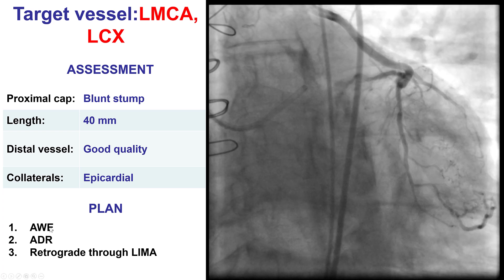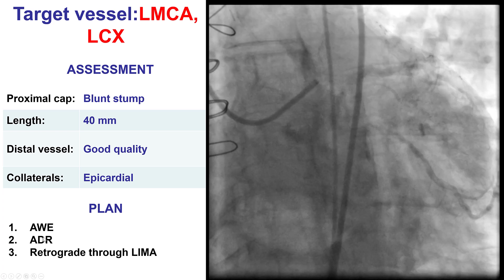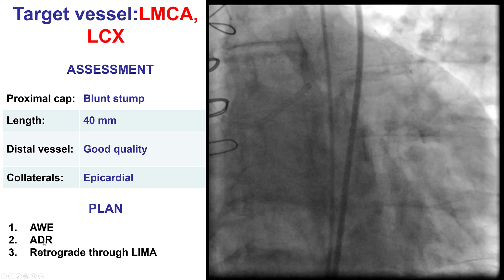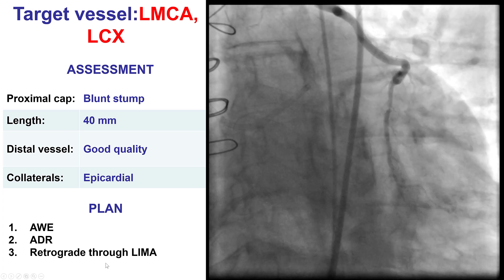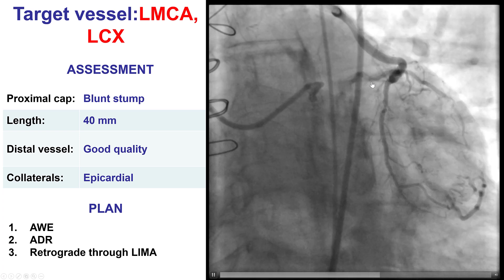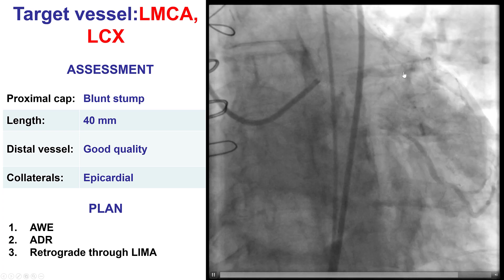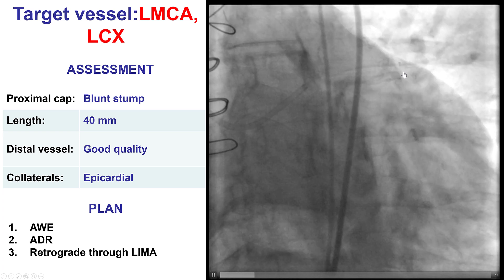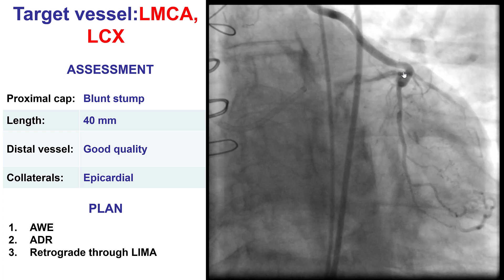Therefore, the plan was to try first with wire escalation, followed by antegrade dissection and re-entry. And then use retrograde through the LIMA only as a last resort, given the potential risks of compromising flow through the main vessel supplying the coronary circulation.